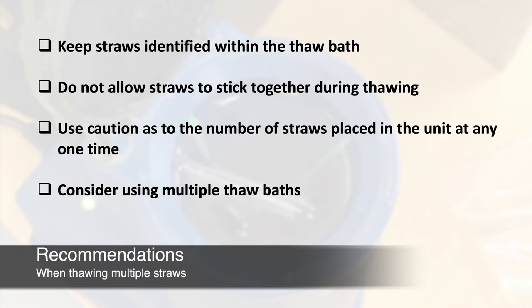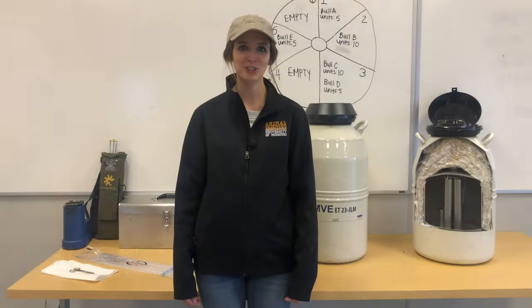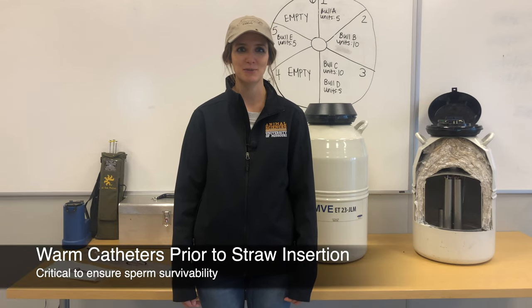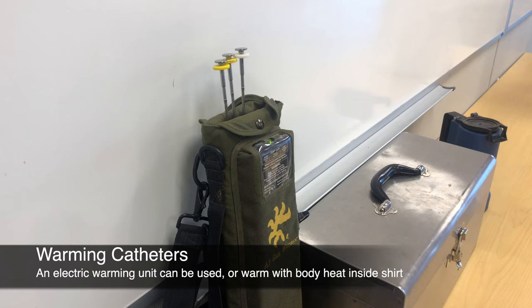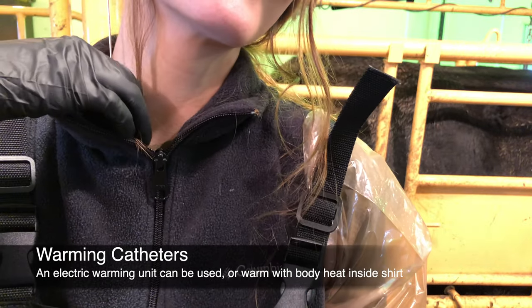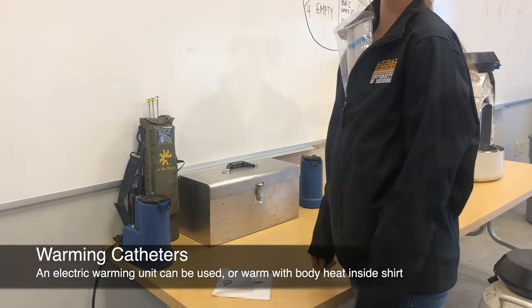Consider using multiple thaw baths to keep up with the rapid AI process or to avoid confusion when using multiple bulls. It is critical that AI catheters are warmed prior to straw insertion to ensure sperm survivability. An electric AI catheter warmer can be used to warm catheters before loading and to maintain the temperature of loaded catheters prior to use. If you do not have an electric warmer, place the catheter inside your shirt until you are ready to load it. AI catheter sheaths can also be tucked into your shirt to keep warm if it is cold outside.